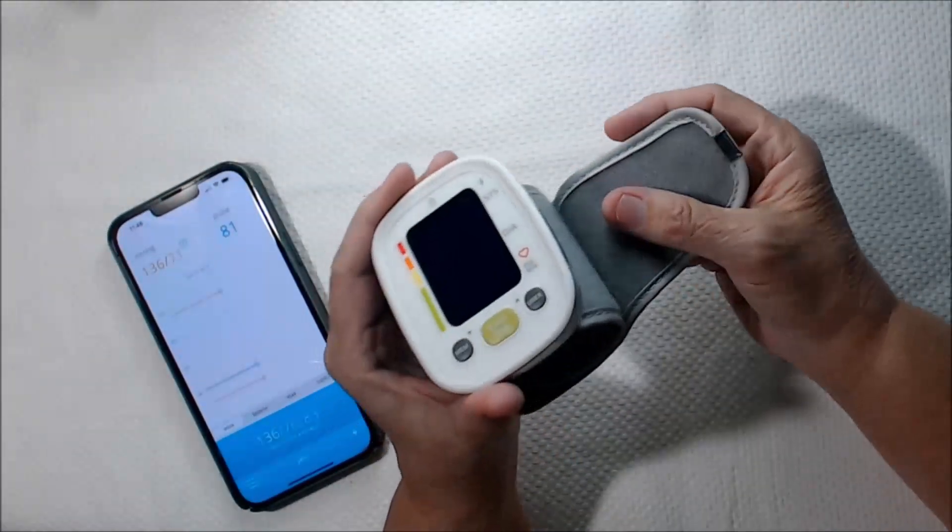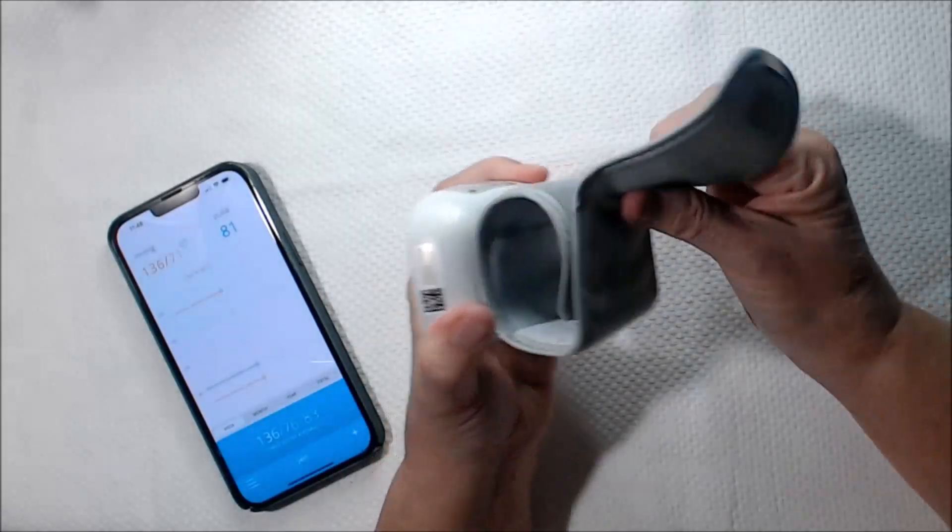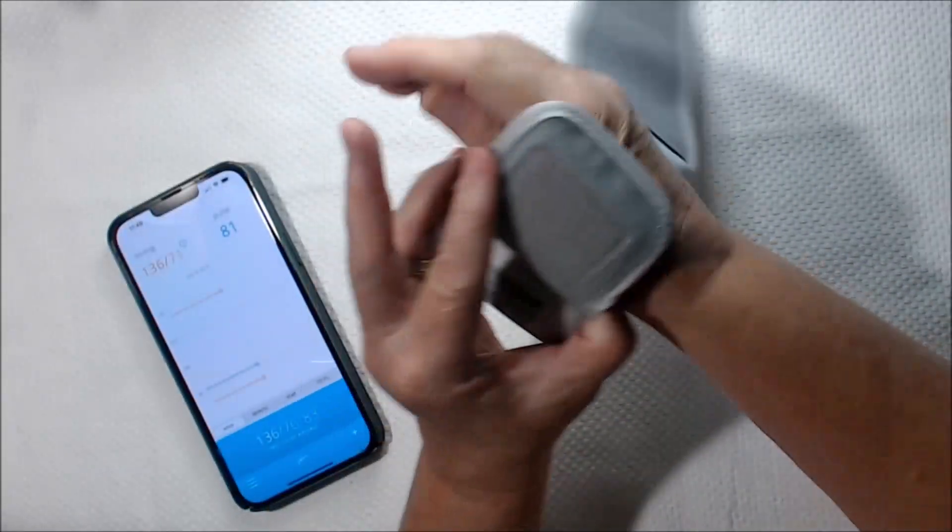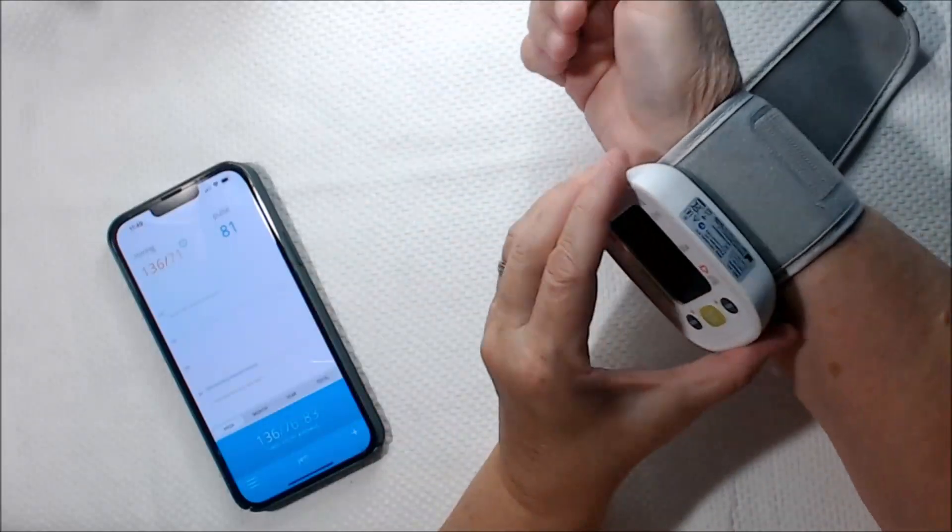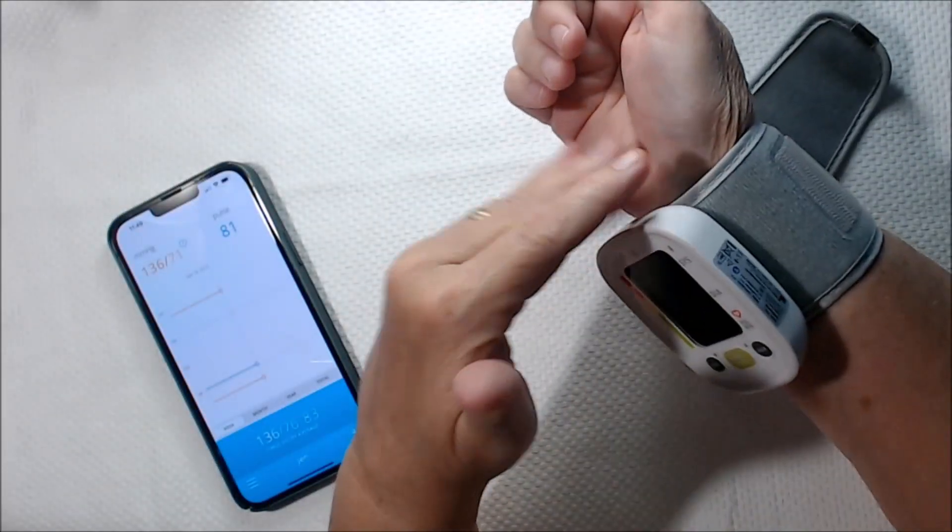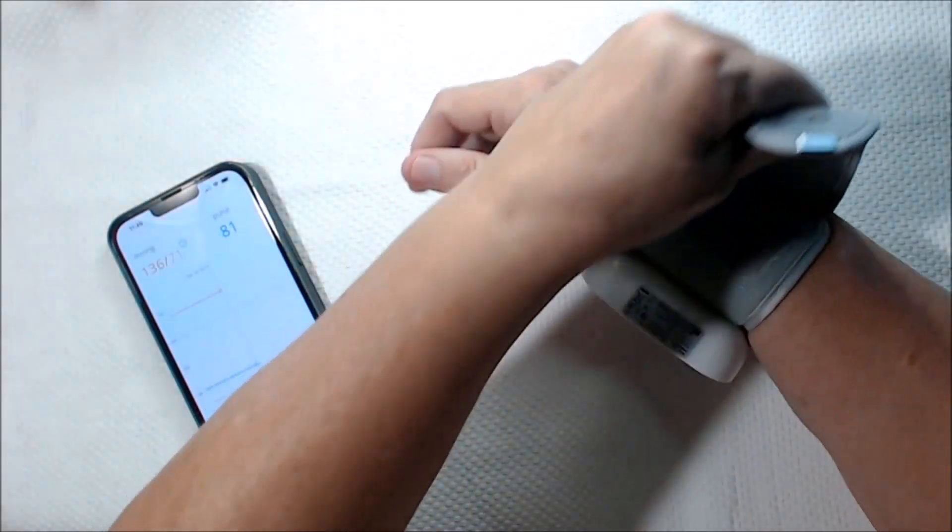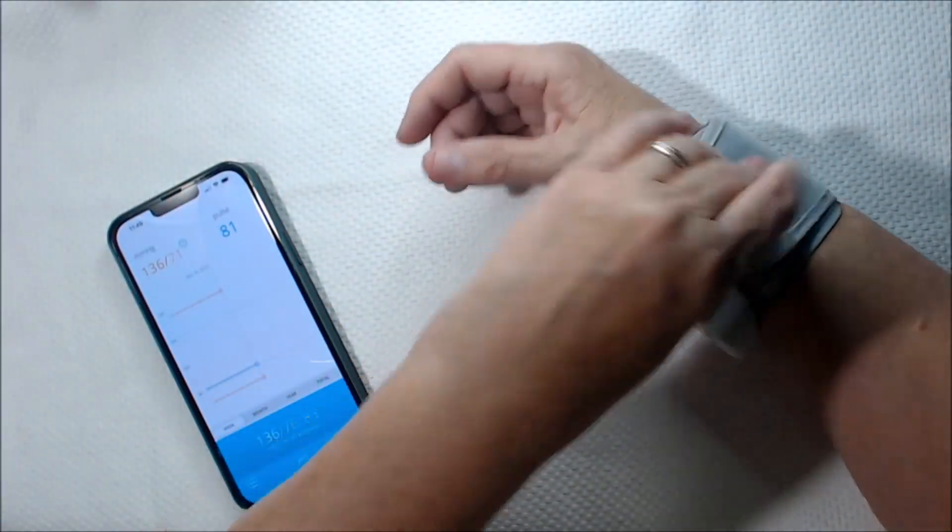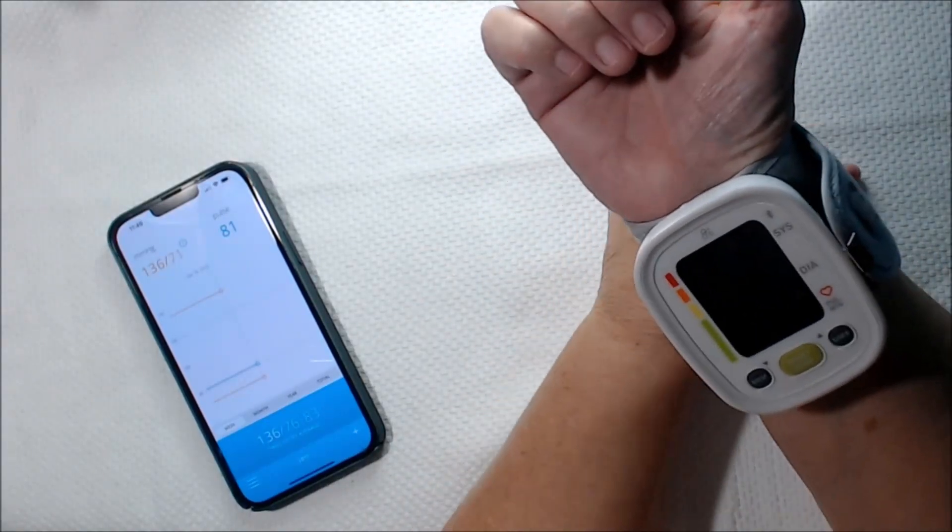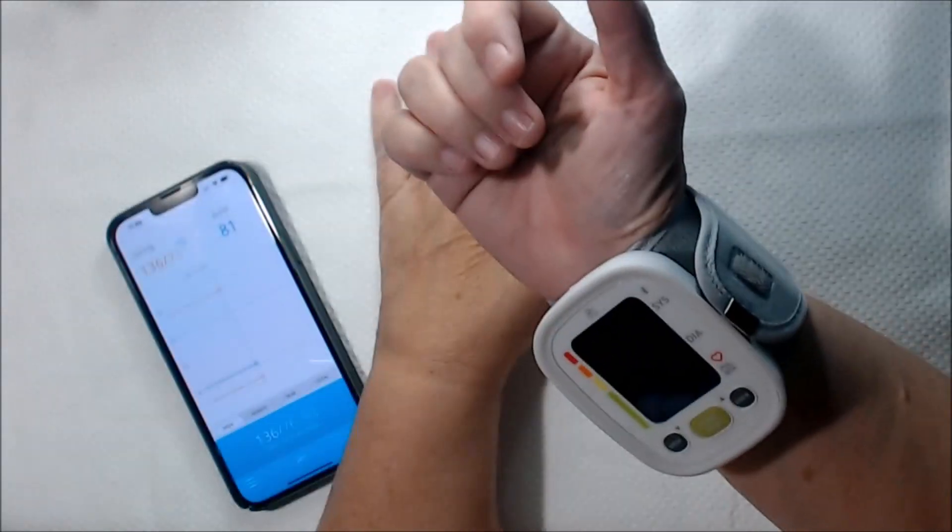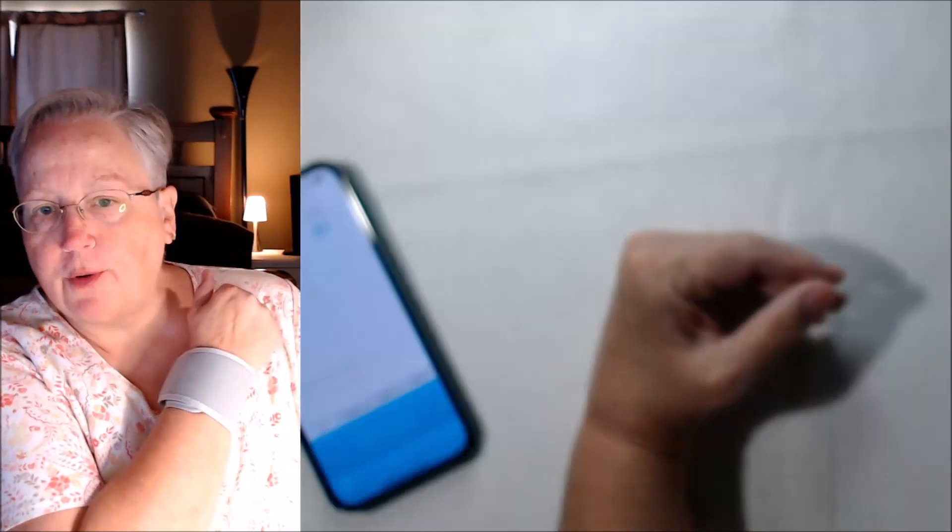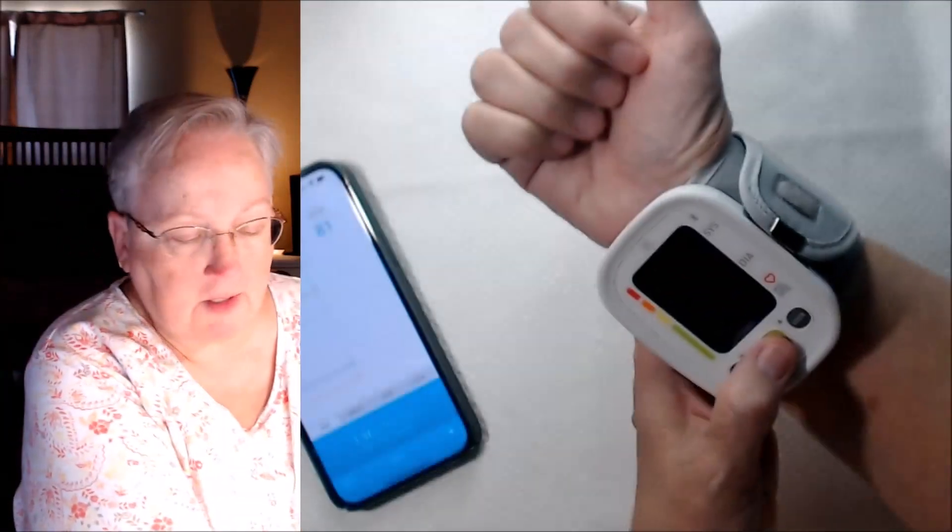We'll go ahead and put this on. It has a super nice Velcro strap, easy to put on. You want the little monitor to face the inside of your wrist. You can tighten it up pretty easily by yourself. You don't need help. You put this up against your wrist, and then you put your cuff up by your heart. So we're going to go ahead and start this thing.